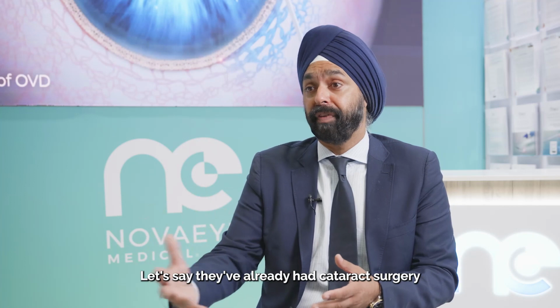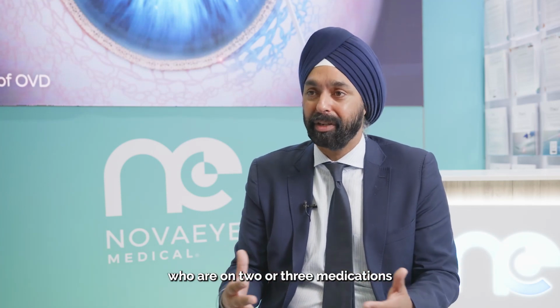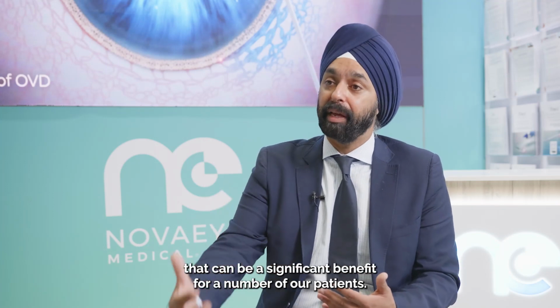And then in patients who are pseudophakic, let's say they've already had cataract surgery 10, 15 years ago before we had a lot of MIGS. Those are the same kind of patients who are on 2 or 3 medications, who are unhappy with drops. Let's just go ahead and do a canaloplasty, even if we can get them off of 1 drop. That can be a significant benefit for a number of our patients.